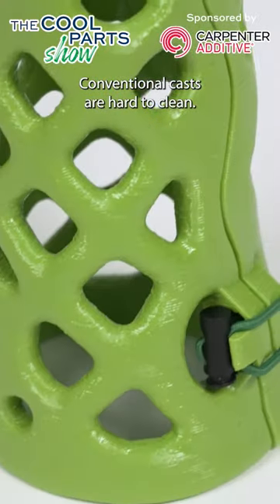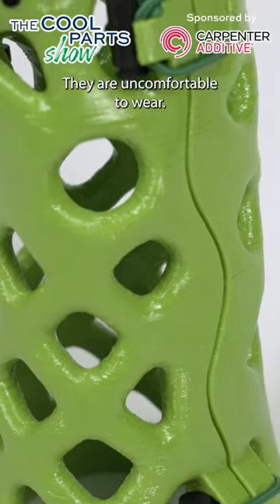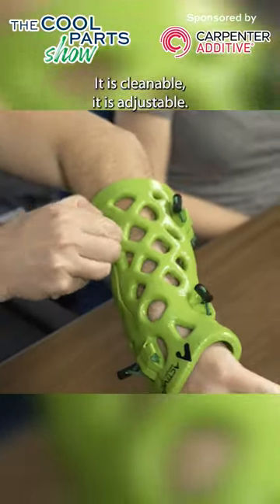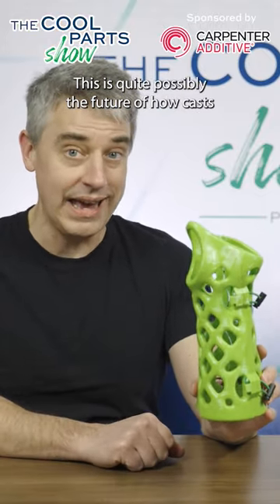Conventional casts are hard to clean, they get dirty, they are uncomfortable to wear, they are not reusable. This cast comes on and off easily, it is cleanable, it is adjustable. This is quite possibly the future of how casts will be produced.